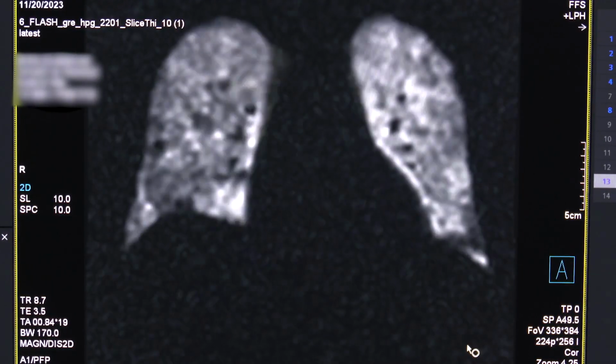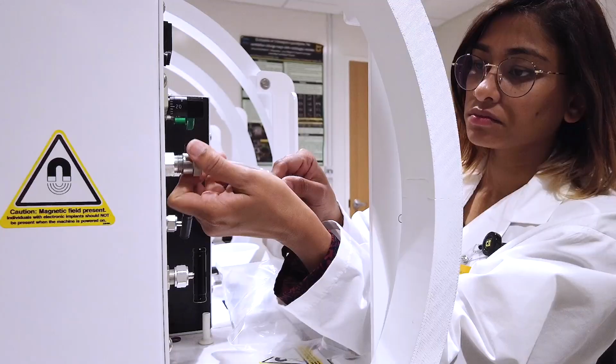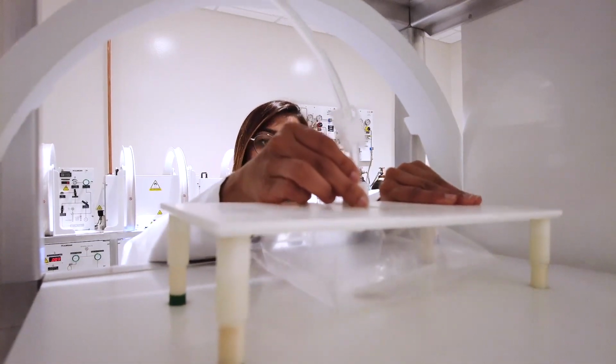Doctors say xenon MRI really helps with lung diseases such as cystic fibrosis, COPD, cancer, and asthma. And another one that I think is very intriguing is what many people call long COVID or post-COVID syndrome. So these are people who got COVID, recovered, but then have persistent symptoms like shortness of breath.